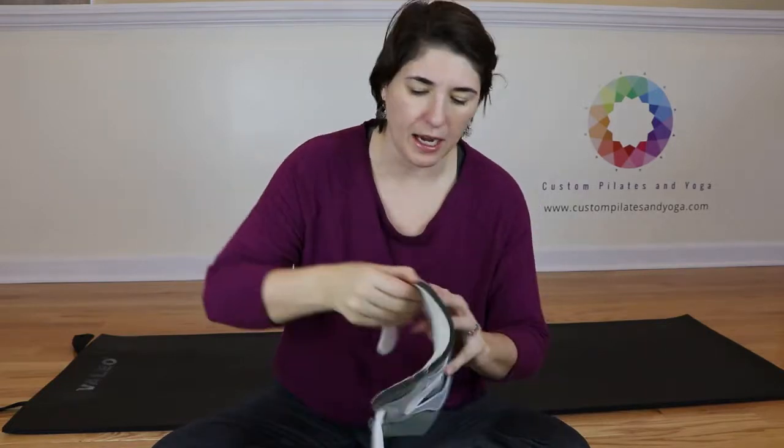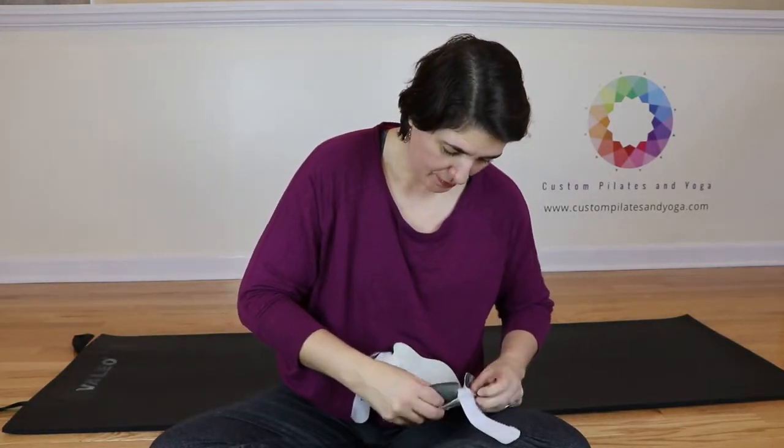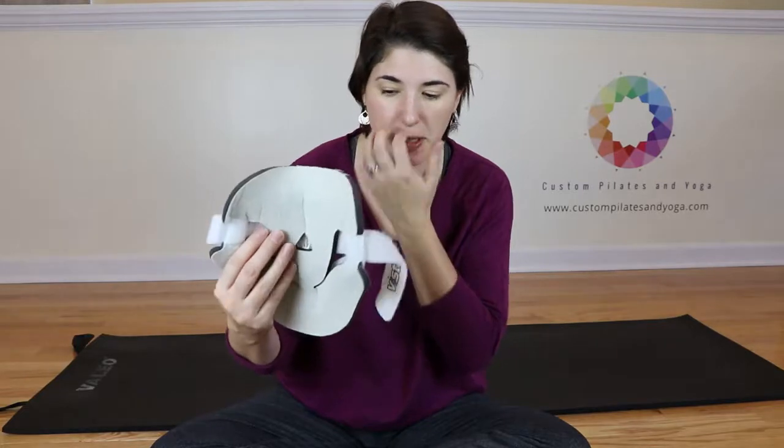You can see I got this corner over here a little high. I might try to scoot that before I get everything all set, just to make sure it's as comfortable and supportive as possible.